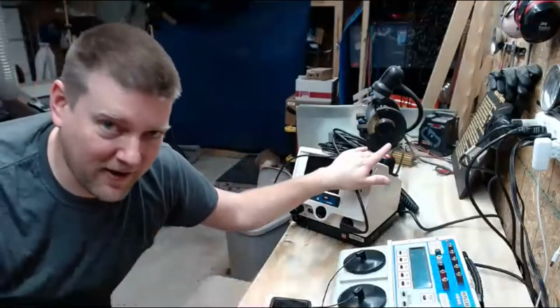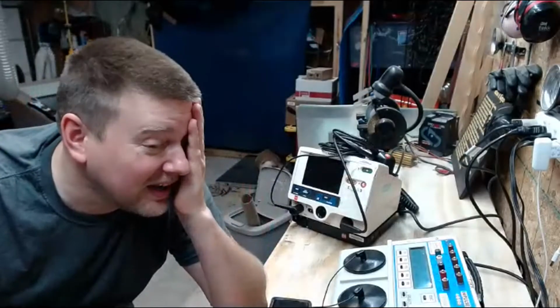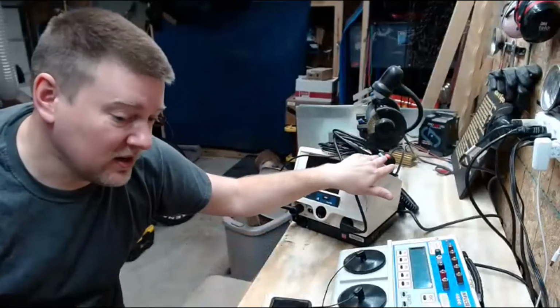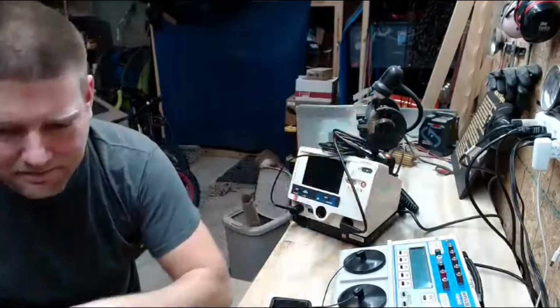I know that there's a Wi-Fi capability to do that. It's up to your hospital to purchase that capability. I can't say that my hospital always does that, or that you have Wi-Fi reception in some of the areas. So we still have to do a walkthrough, and we still have to verify that the hour reset.